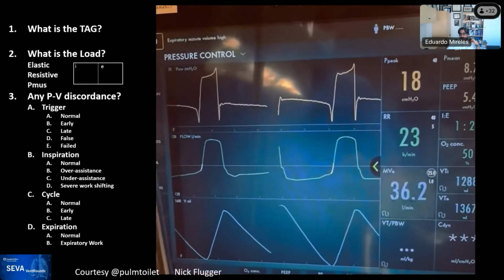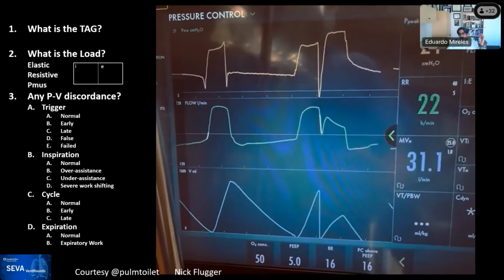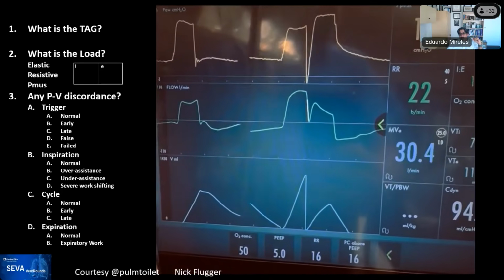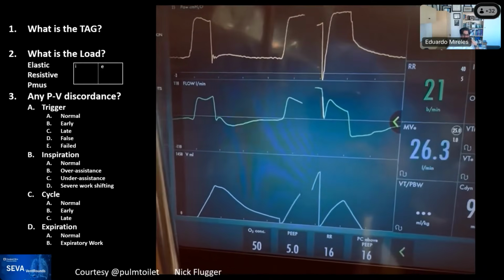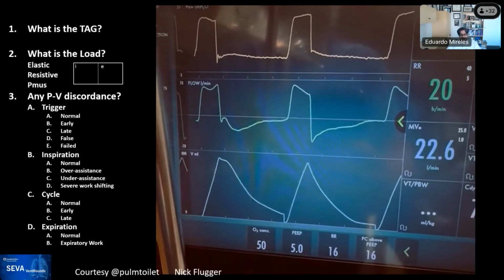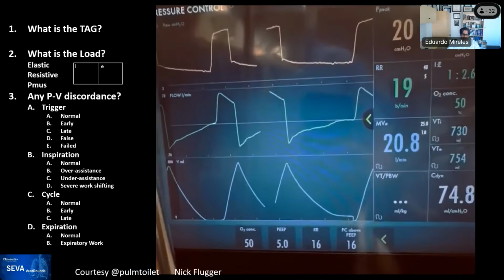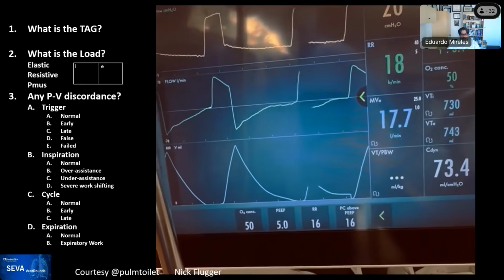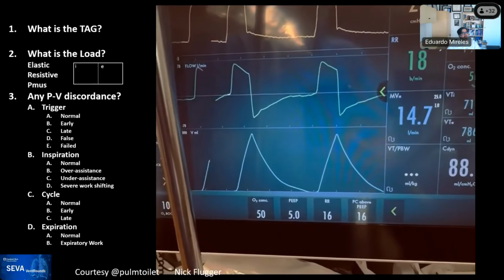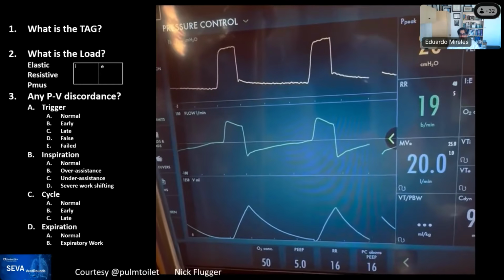Absolutely. And Lorenzo talks again about the non-invasive with servo, so ASV. Although I would say, and I don't treat this anymore on the outpatient, but I believe ASV has a black box warning if you have a low ejection fraction because of the SERVE-HF trial that showed increased mortality, I think.